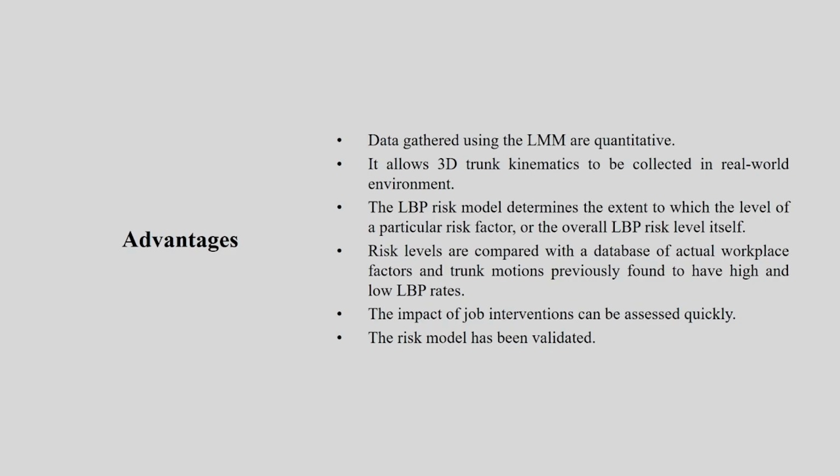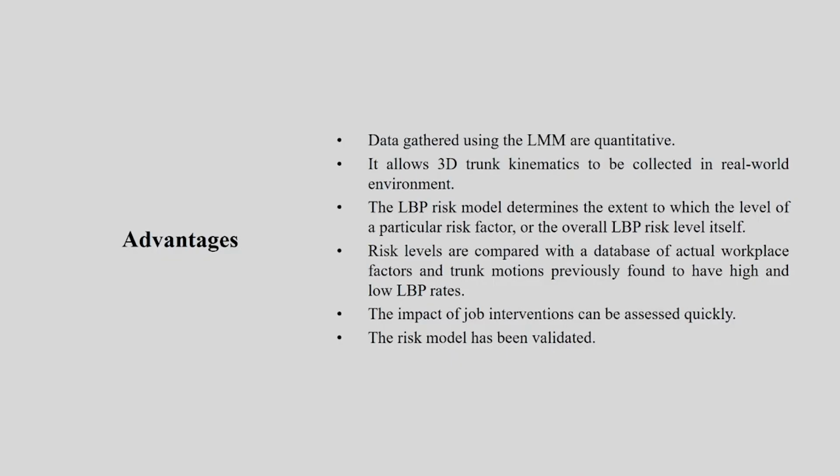Data gathered using LMM are very quantitative in nature. So you have a lot of numerical values and you have a lot of scope to do a variety of statistical analyses using this type of data. It allows 3D trunk kinematics to be collected in a real world environment.